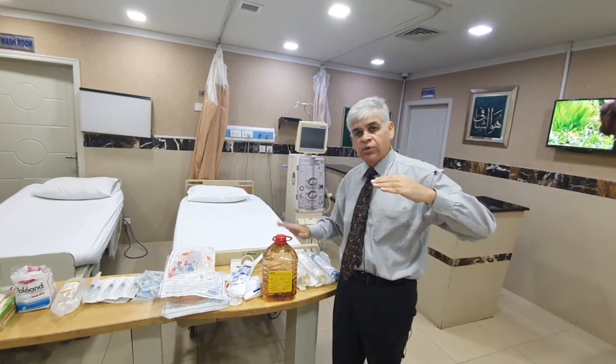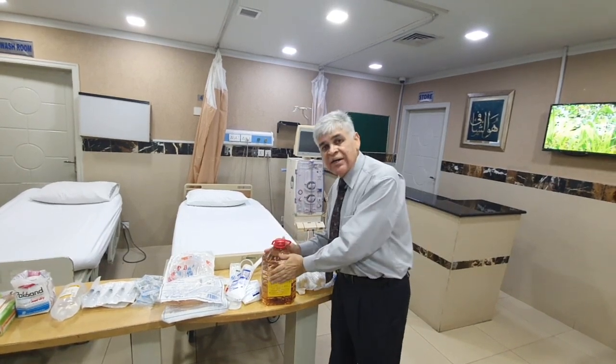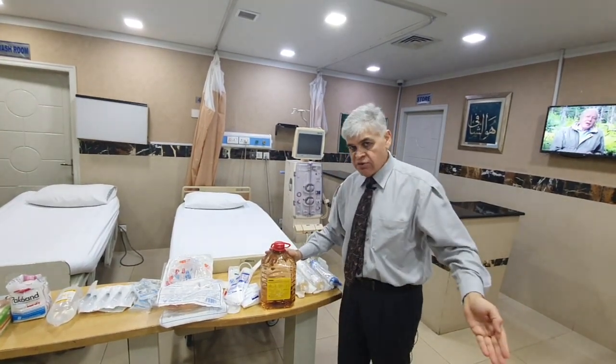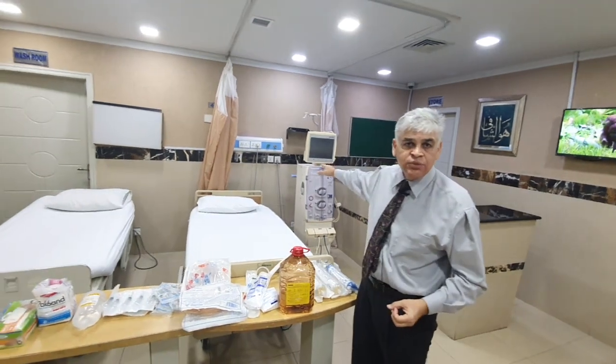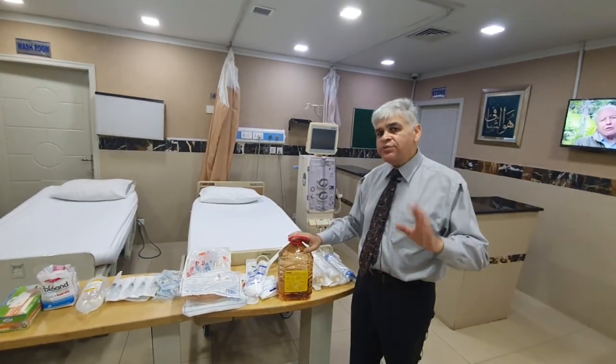And then this also contains sugar, and it contains potassium. So this part contains 5 different essential ingredients of varying concentrations. The rest, how much you want to go in, how much you want to plan, is done by the dialysis machine, which you program. So it's quite technical, but it's very important to understand.